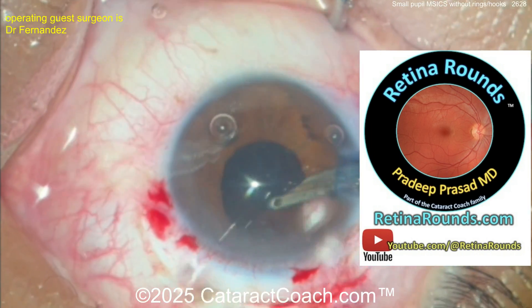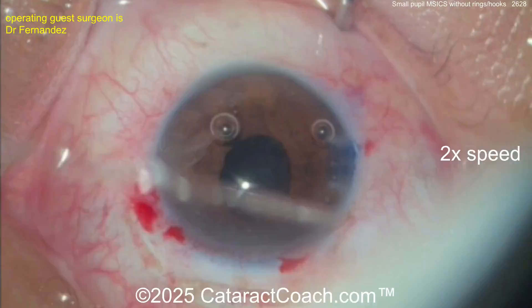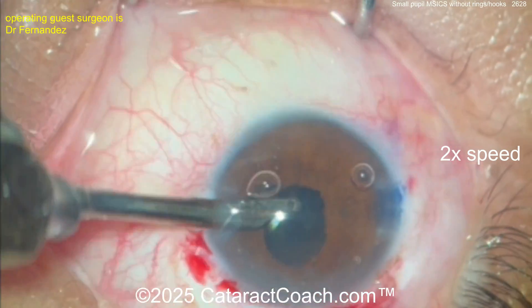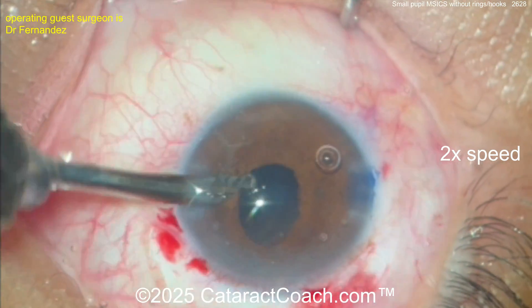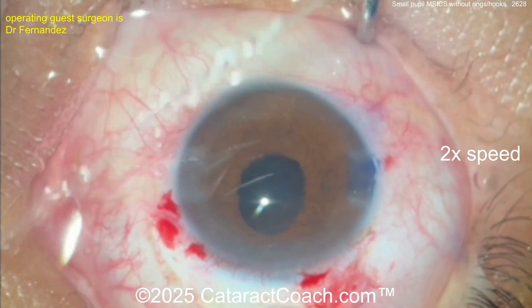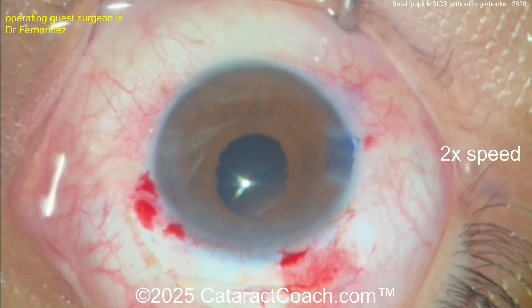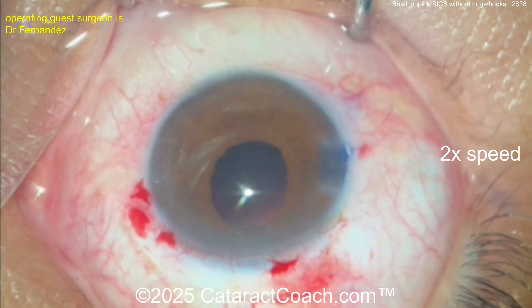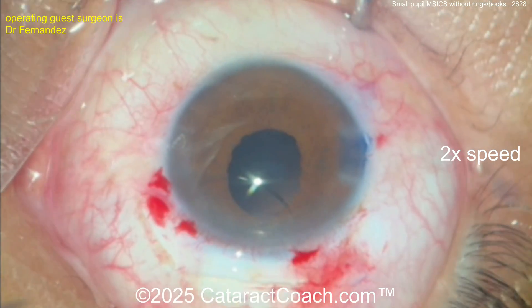Now going over to the Simcoe cannula to remove the cortex — make sure you really get all the cortex out. In a case like this I like to have a Simcoe cannula in one hand and the other hand free to lift up the iris to check for complete cortical cleanup. Alternatively, once you put viscoelastic in the bag, use your chopper or a hook to lift up the iris 360 degrees to confirm: number one, the IOL is in the capsular bag, and number two, there is no retained lens material or cortex adherent to the capsular bag equator.